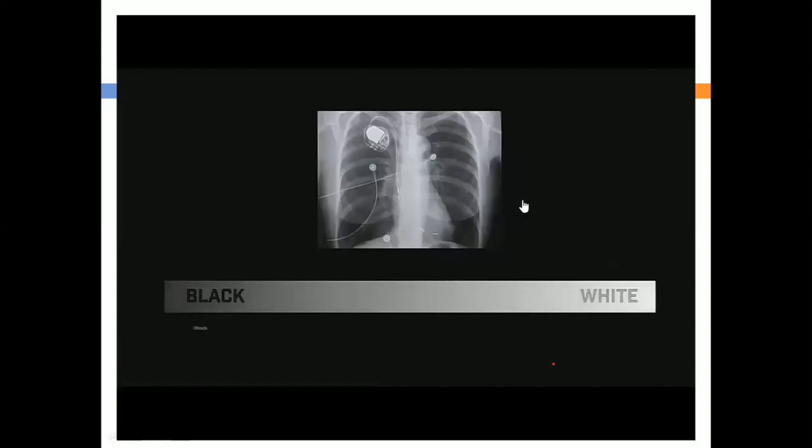Now when you see X-rays, we can differentiate four regions from black to white: black, gray, off-white, and white. The black regions are radiolucent, as we discussed. This kind of black happens where there are lungs. The tissue resistance of lung tissue is not much, and there is an exchange of air, because of which there will be black color.